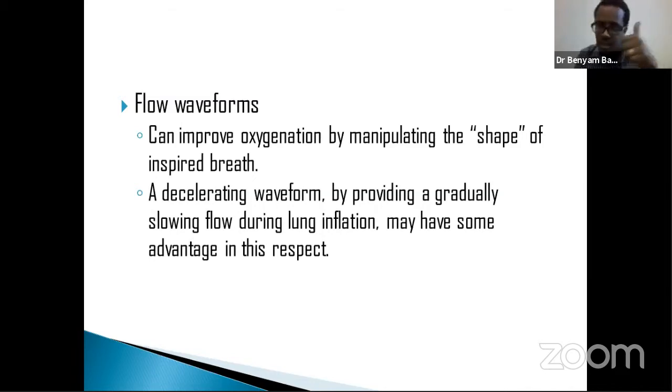But the main important point to take away is that to increase oxygenation, we may have to affect FiO2. Of course, if the oxygen you give is higher, then you'll have a high oxygen level. And PEEP, which is technically the mean airway pressure, so you can adjust the PEEP and affect the inspiratory time. So it will affect the mean airway pressure, and you'll have good oxygenation. So keep in mind, and the last option is flow waveforms, okay?